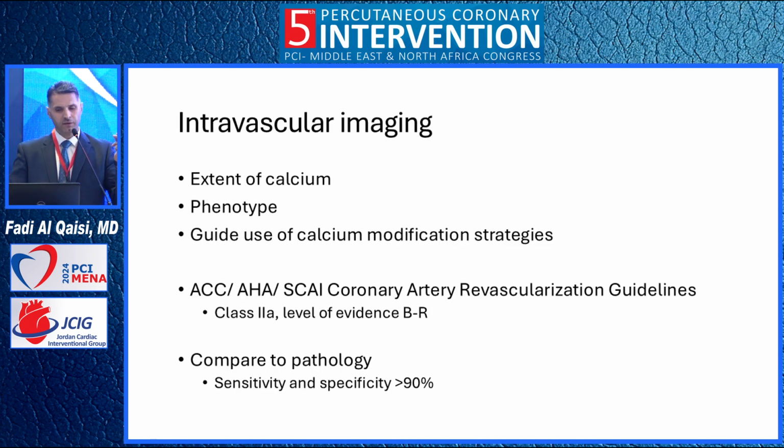And that's why we must use intravascular imaging to evaluate the extent of the calcium, the phenotype of the calcium, and to guide our choice of the modality to handle the calcium. The recent guidelines classify the use of intravascular imaging as class 2A. All of us have been in conferences where every case is shown with IVUS or OCT. And when you compare it to pathology, it's a very accurate method, with sensitivity and specificity of more than 90%.